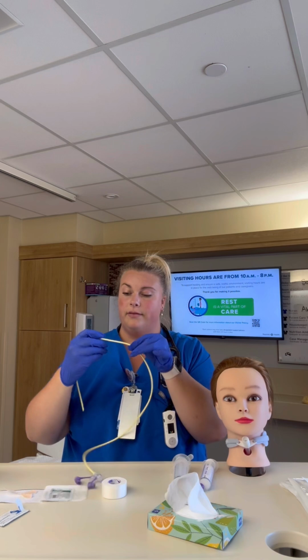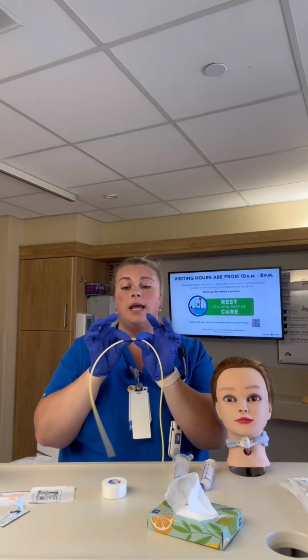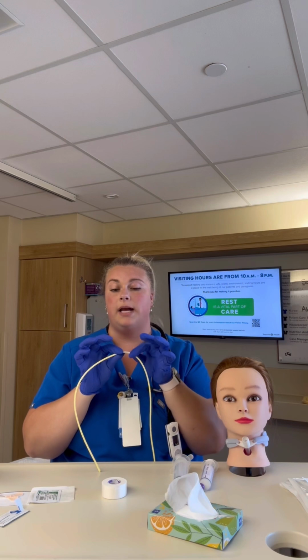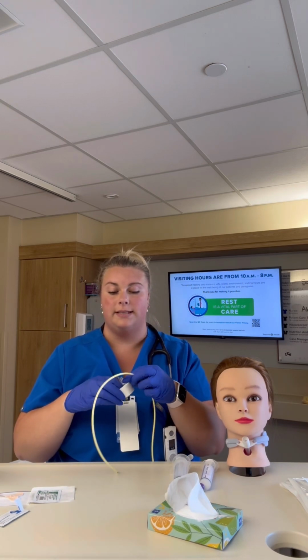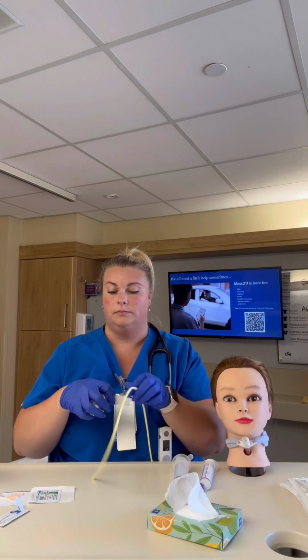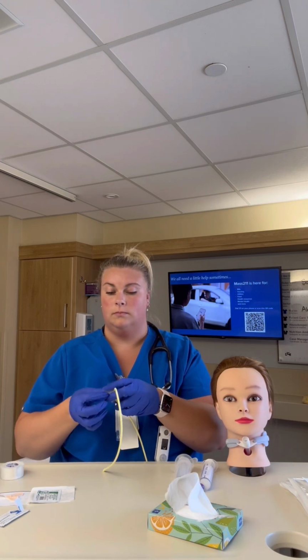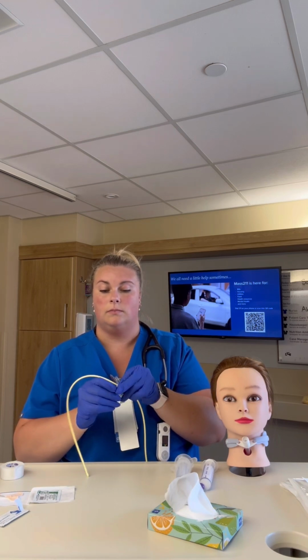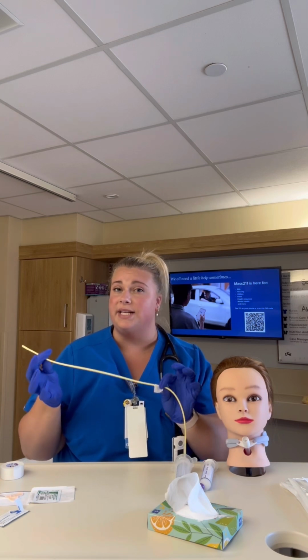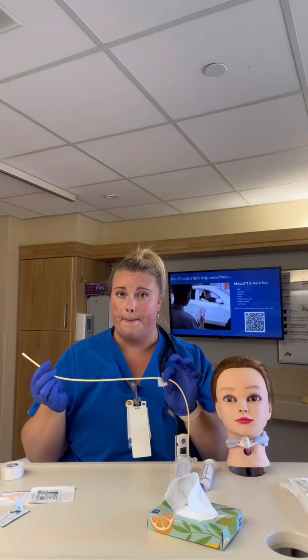Once we have our spot marked on our tube, in Mrs. Smith, it's going to be 35 on our tube. We're going to mark it with a piece of tape. Now that it's marked, we know where we need to insert the tube to make sure it's in the proper location.